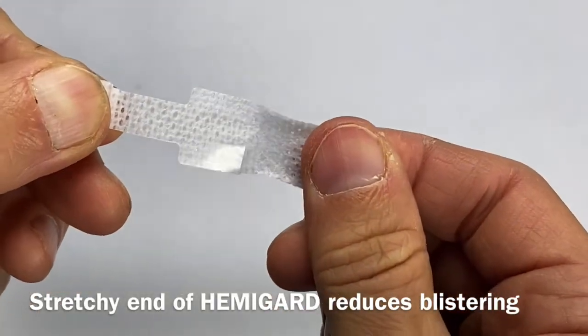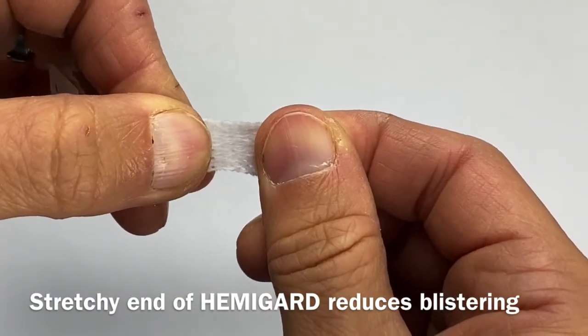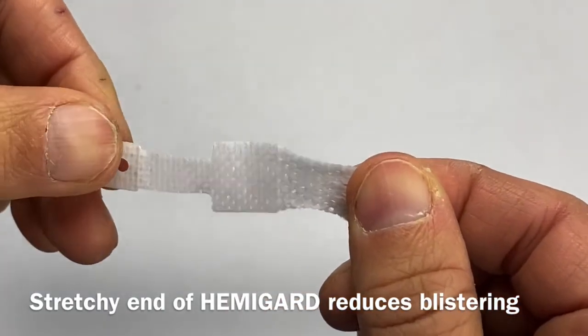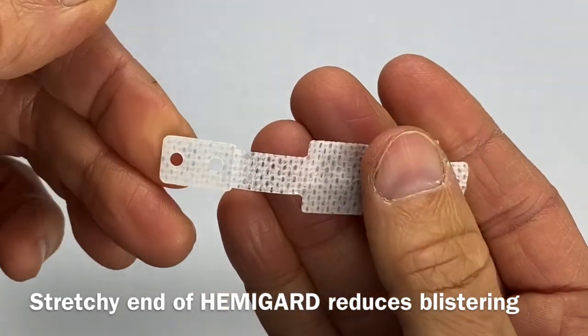In order to prevent blistering at the trailing edge of the HemiGuard, the material is quite stretchy and minimally stiff. These HemiGuard are available immediately on our SutureGuard store, so reach out for a sample or just to connect. Thanks.